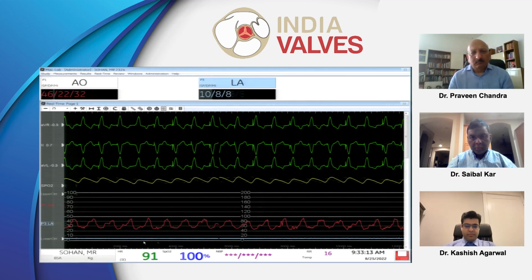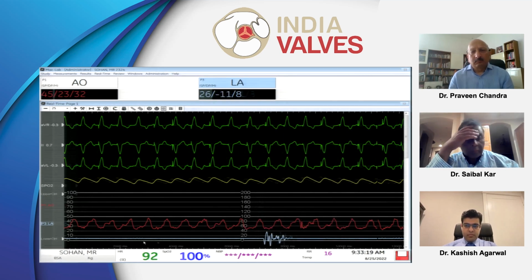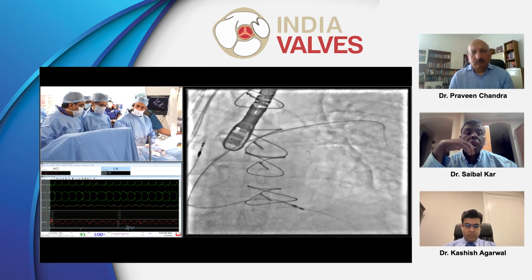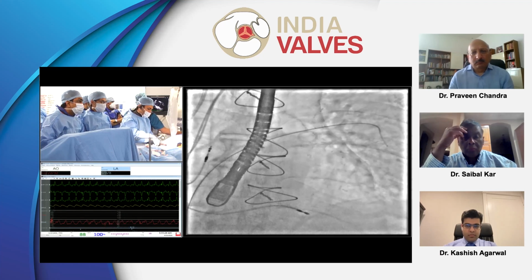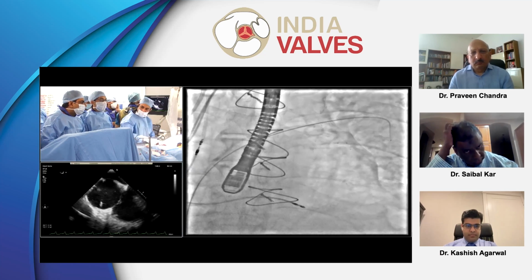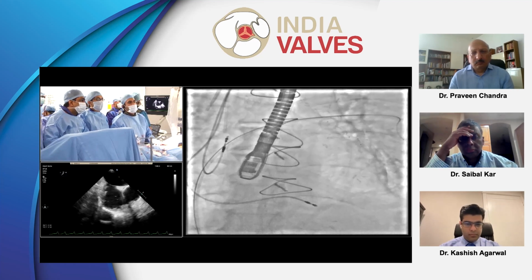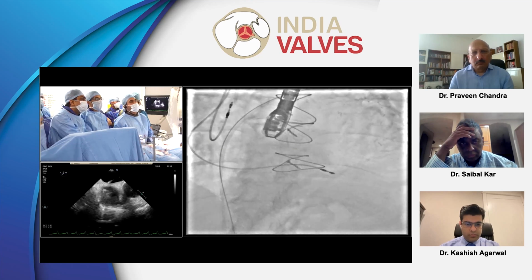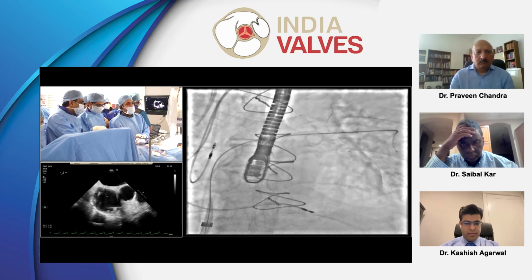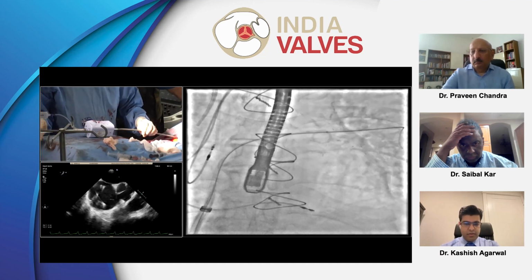Okay. So hold the guiding. So this is a guiding catheter. You put negative on it, make it straight, and we're going to go ahead and enter. Okay. Hold the wire, please. Hold it here. Just rotate a little bit. Okay, there it goes. Okay, Prashant, so we're going to come up. Hold the wire, please. Show me the guiding catheter. Okay, so we're going to make it neutral here. I usually counterclock a little bit as you come through the septum. It will make you go anterior as you're crossing the septum, and then take the negative off once you're inside.